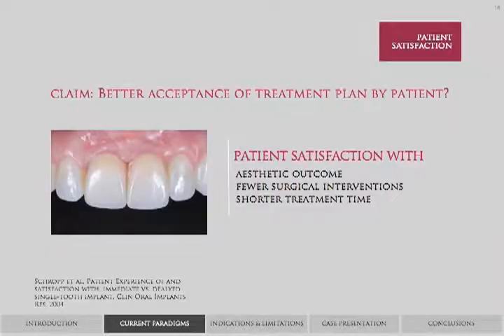Don't let the patient, however, dictate treatment. Patient satisfaction with the aesthetic outcome is key. There are fewer surgical interventions and shorter treatment time with immediate implant placement. And we talked about the different times we wait.